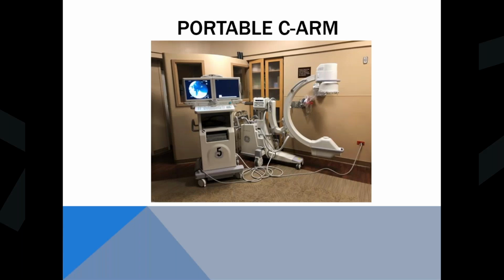The more advanced setting is the cine image. It'll actually do a complete series of imaging. So say you do a run of 30 photos, it'll get stitched into one continuous view so that you can watch it over a timeline and record the movements. Like in the OR, say they're doing work on the elbow and want to make sure that the elbow has its full range of motion, they can do a cine run.